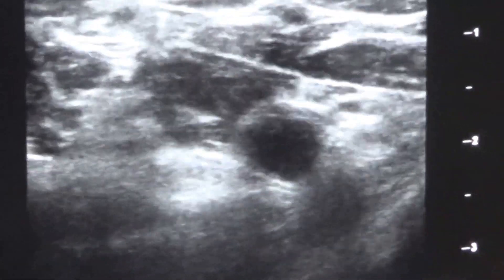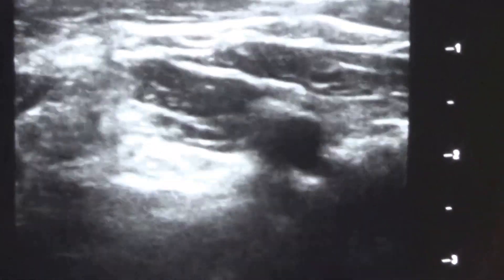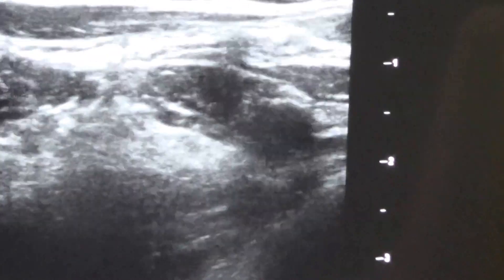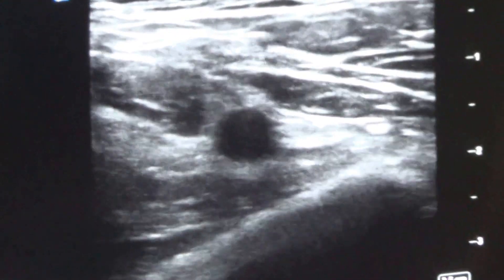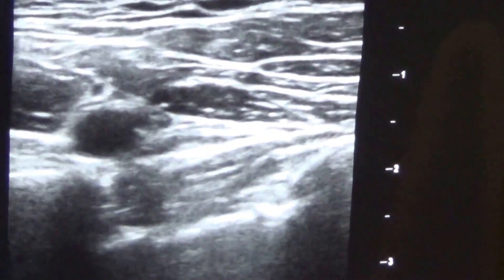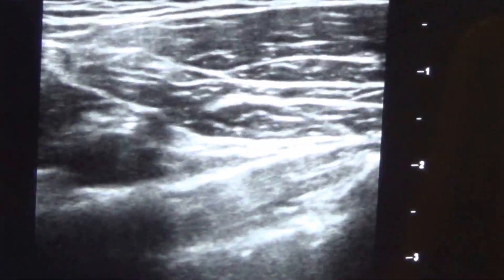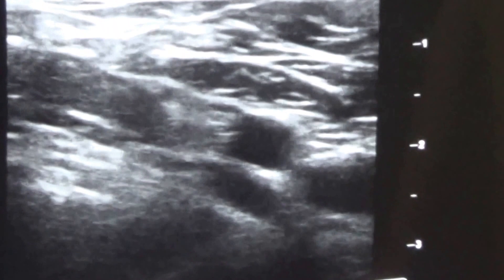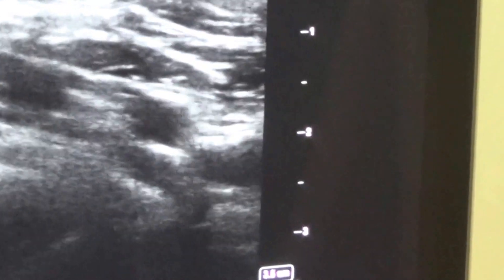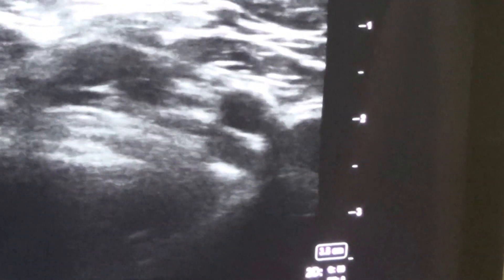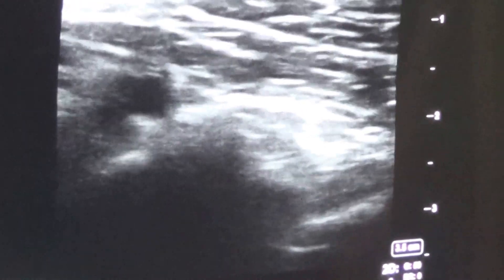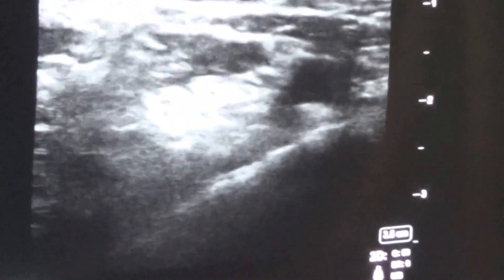If you release the pressure, you can see the vein as well. Since this location is far away from the lung, you can avoid pneumothorax. The subclavian artery is visible here; releasing pressure reveals the subclavian vein. Once you bring the vein into view — this is the artery, release pressure and start seeing the vein — this same approach can be used for subclavian CVP cannulation.